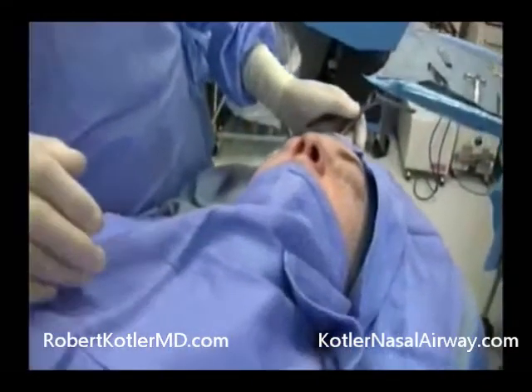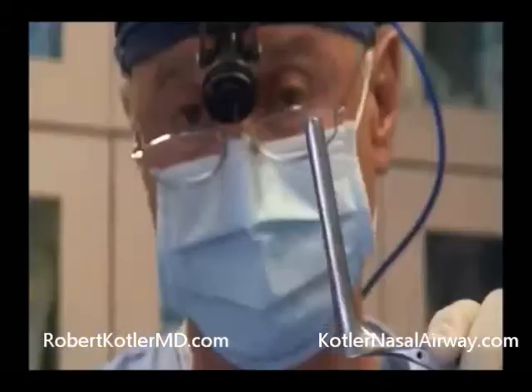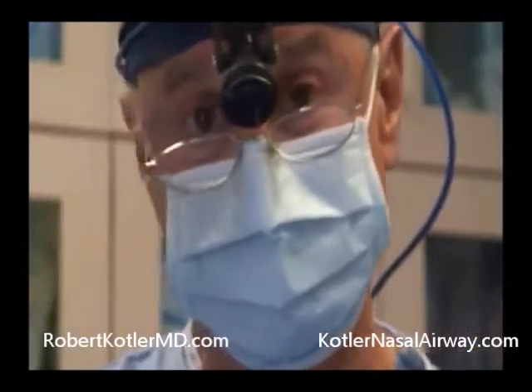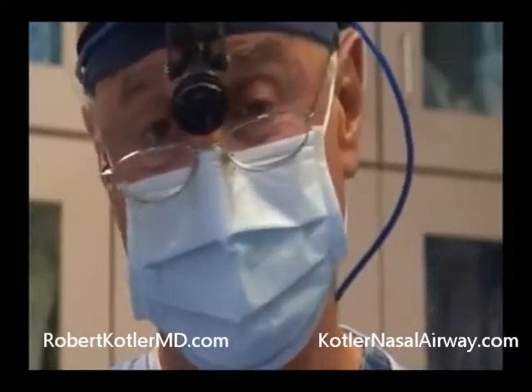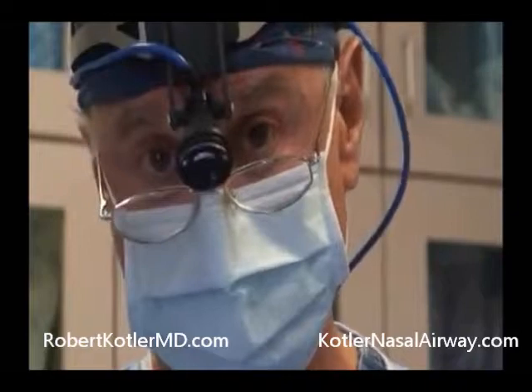We're finished with the nasal surgery. We're about ready to put in the nasal airway. I should mention, incidentally, as needed, depending on the anatomy, often we'll laterally fracture the inferior turbinates using our large, long speculum. 2 reasons. 1, gives a little extra room for insertion, but most importantly also gives the patient just a little more breathing room.